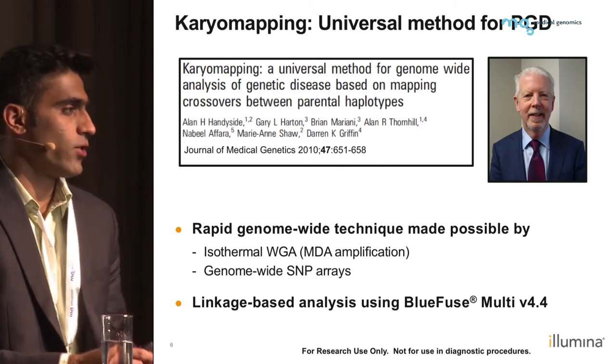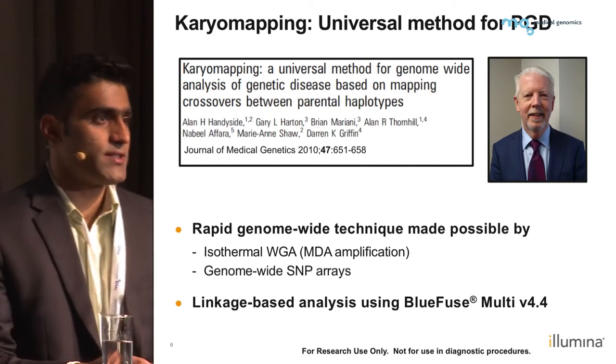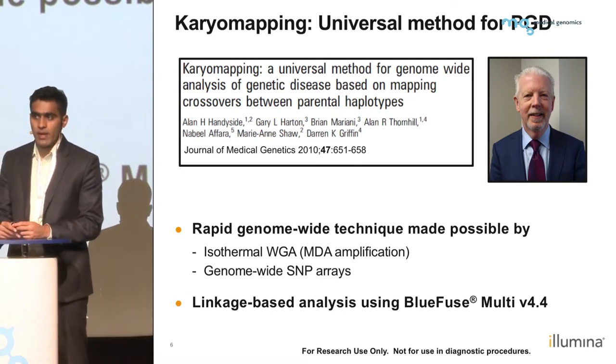So, Dr. Alan Handyside, who we saw earlier, was involved in the first PGD babies in the early 90s. He invented a universal method called karyomapping.